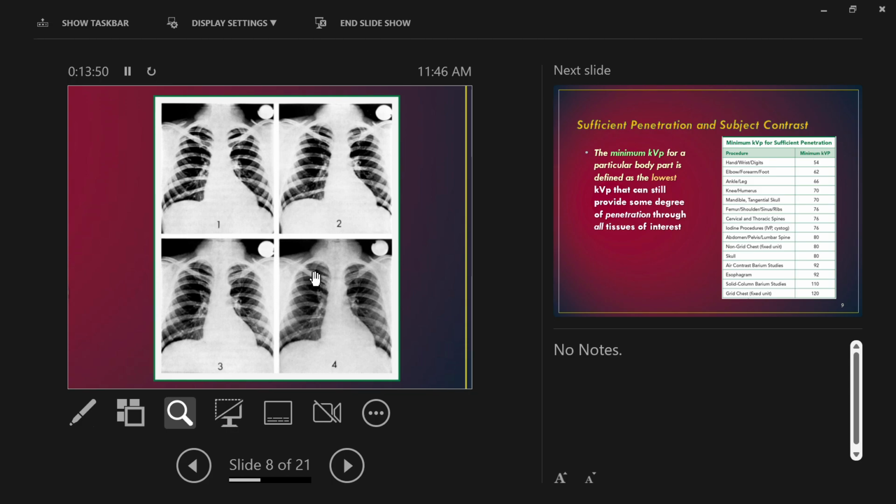Harder to see, I'll grant you that, but it's there. I can begin to notice a rib. I can sort of follow this rib to behind the heart. That one too, that one too. We've penetrated the heart now. The heart, which was not penetrated, now gets penetrated. The heart's a muscle. Now we're penetrating the muscle a little bit better by just adjusting beam energy.